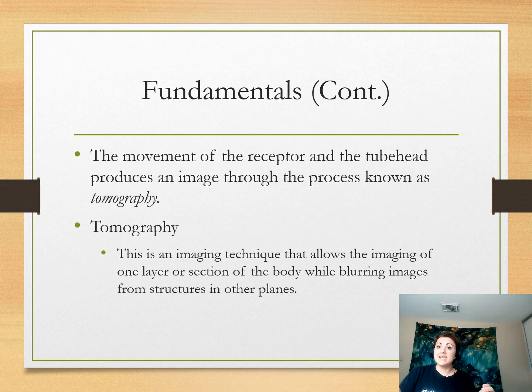This is the reason that there are certain sections that are blurred, because one structure, sometimes maybe the spine or the hyoid bone or some of those other structures, will actually get in the way of the x-ray as it's penetrating in order to get to the teeth, because there's a whole lot of stuff in between the back of my head and my teeth.